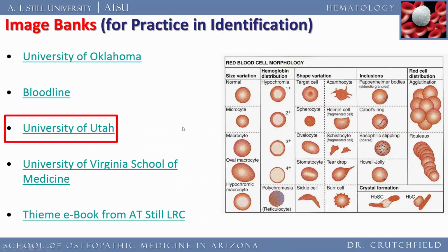So, no, I am not a hematologist. I'm a surgeon, but we are looking at probably 10 to 50 CBCs every day, and after a while, they expect you to know what you're looking at. So what's interesting is you're going to need some image banks to go to, and you can click on any of these links on the PowerPoint that will take you to some sites that have really nice images of CBCs.